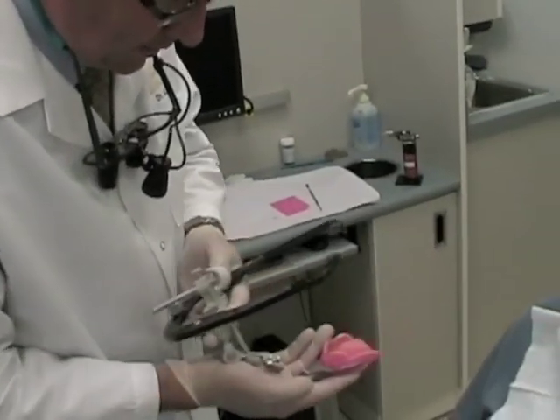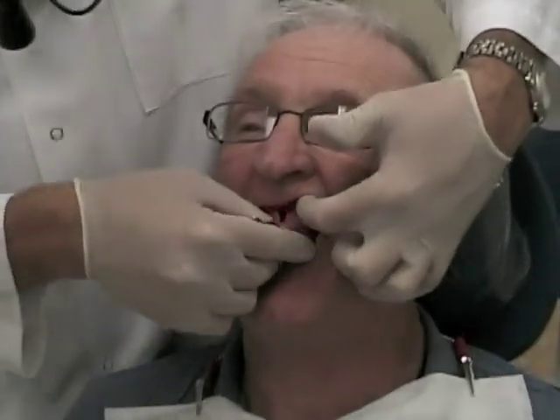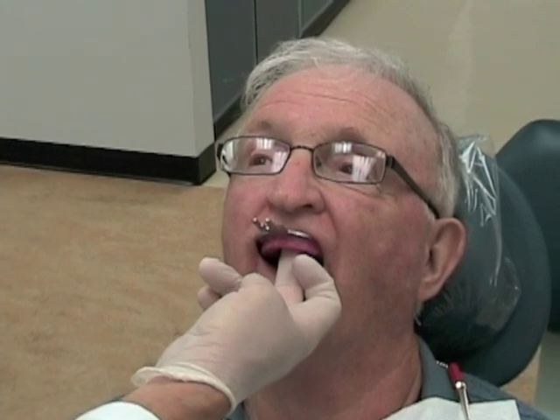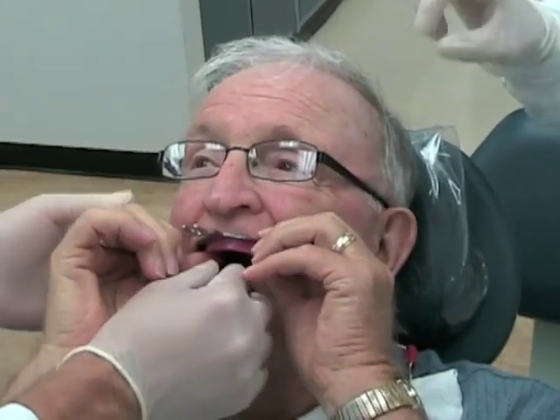Explain to the patient what you will be doing before you begin. Next, insert the record base wax rim attached to the bite fork into the patient's mouth. Seat it firmly and then have the patient assist in stabilizing the record base using their thumbs on the occlusal surface of the wax rim on both sides, moving their fingers out of the way as you place the face bow.